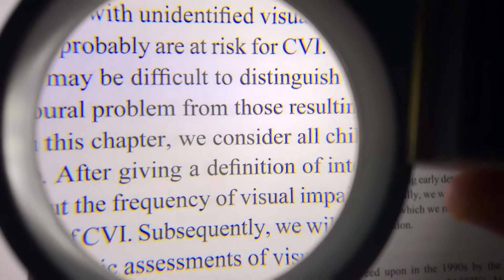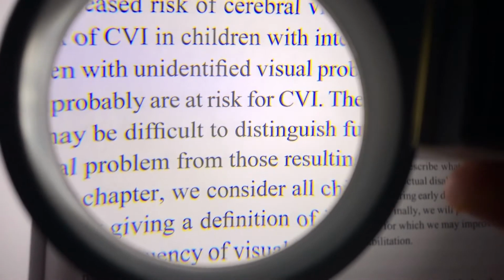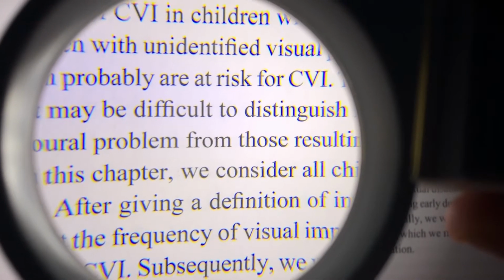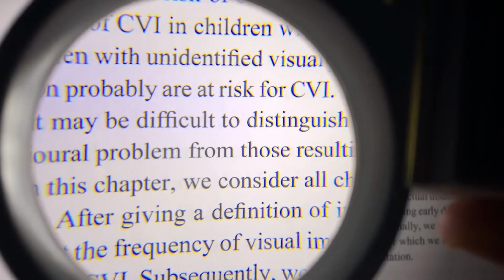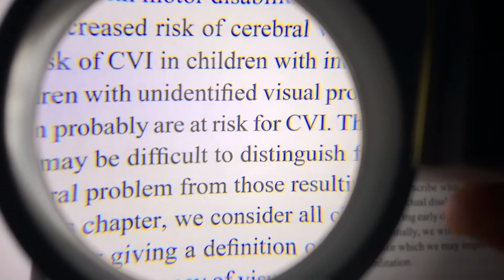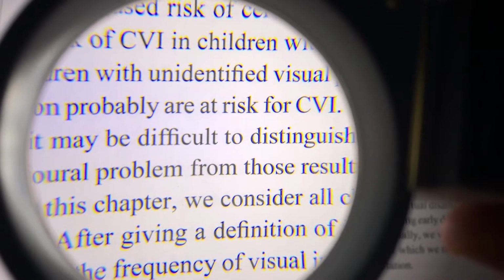We'll compare now the 4X Magno handheld magnifier. This is a smaller viewing area than the 4X from Optelec. However, remember it is 16 diopters as opposed to 12. A general rule of thumb is that you divide by 4 to determine the power of magnification with diopters. And so if this is 16 diopters, that is a true 4X magnifier, whereas with the other one, 12 diopters would be closer to a 3.